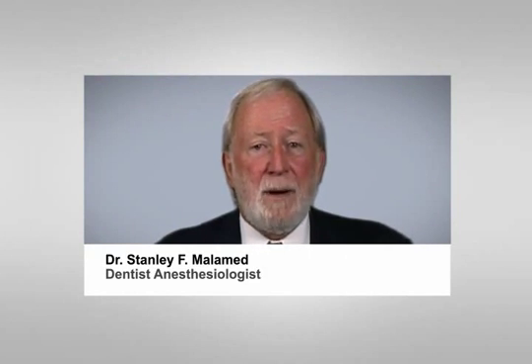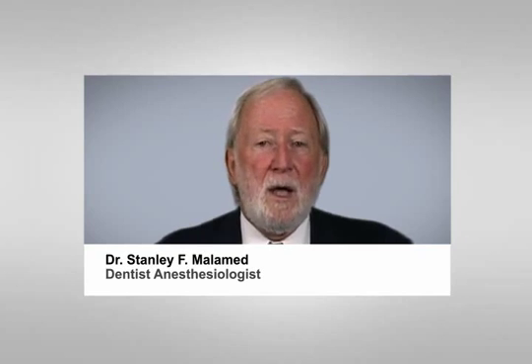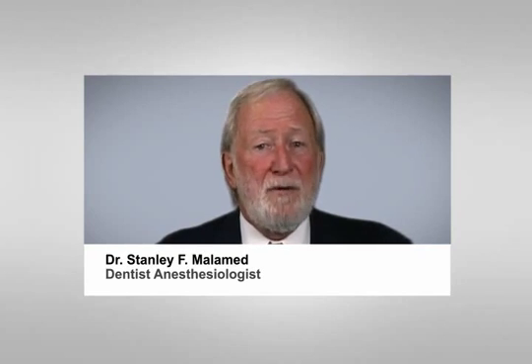You will find that using the STA system, the STA wand handpiece and birotational insertion technique will allow you to deliver a more comfortable mandibular block with a greater success rate and a shorter onset of anesthesia.